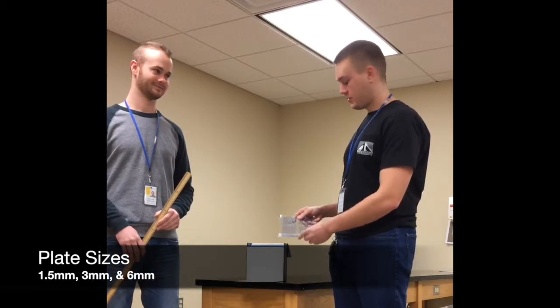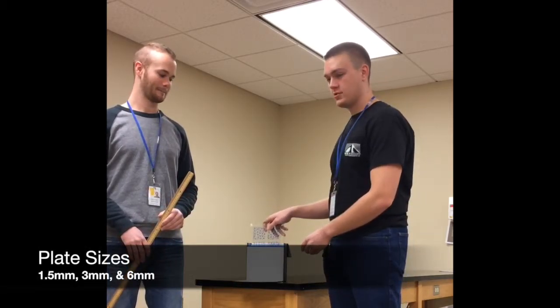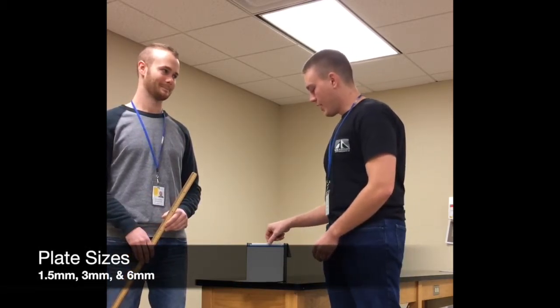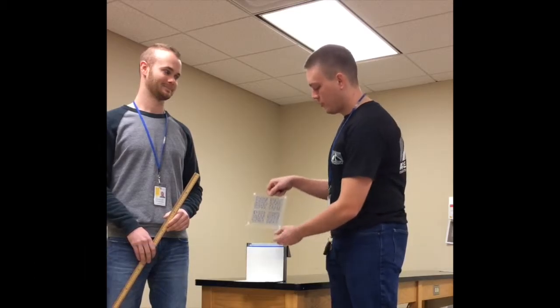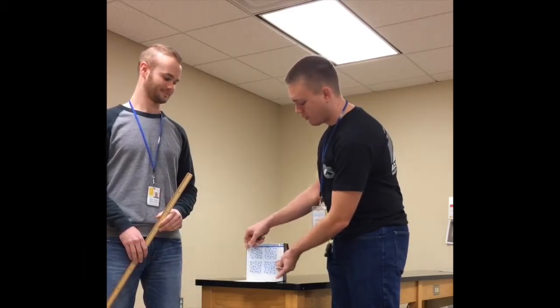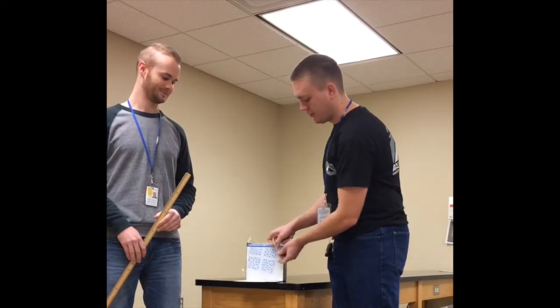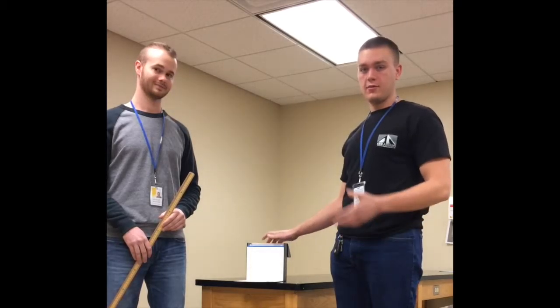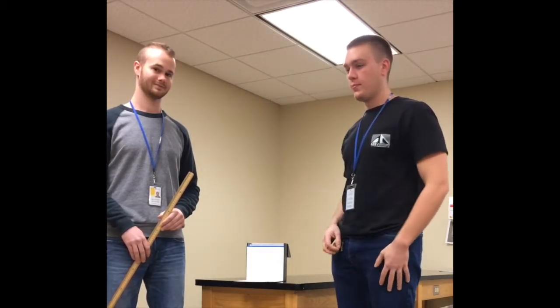The three plate sizes are six millimeters, three millimeters, and one and a half millimeters. Each time we do a different trial, we rotate the plate so it has a better random chance for the patient guessing.